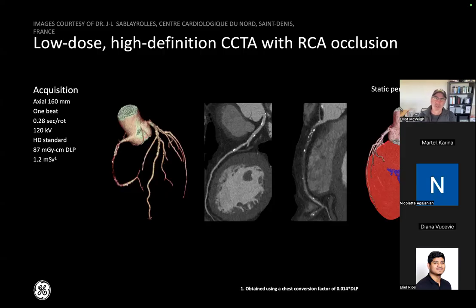The other thing that's been shown recently, as some of the complaints about CT obviously are, is that you have to use ionizing radiation. And what's the optimal amount of ionizing radiation to deliver to somebody? Probably the optimal amount is zero. You don't want to give them additional ionizing radiation beyond the 3 millisieverts they get just walking around. So there has been a real solid push to try and drop these doses down to a small fraction, like a third of what just the baseline dose is for staying alive.